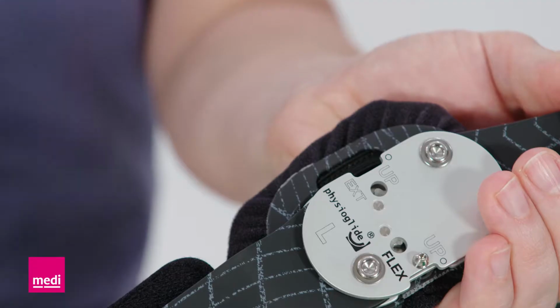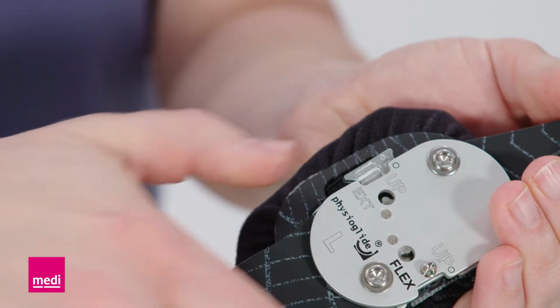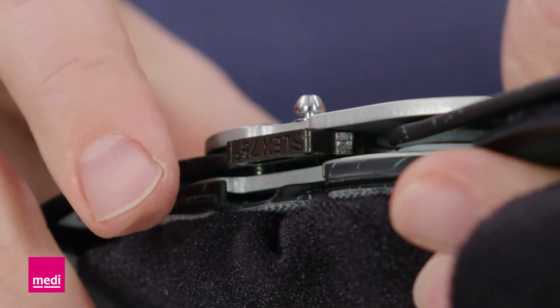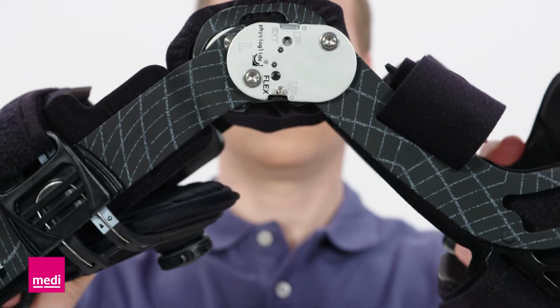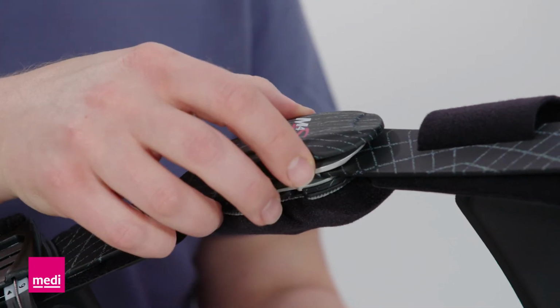Always push the silver-colored wedge into the hinge from the front, and always push the black flexible wedge into the hinge from the rear. This is to make sure that the label up is the same on the hinge and on the wedge. A click will confirm that the wedge has locked. Then move the orthosis hinge and check that it is working correctly. Reattach the hinge cover.